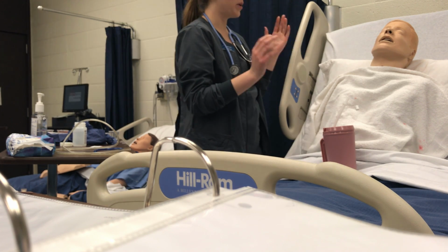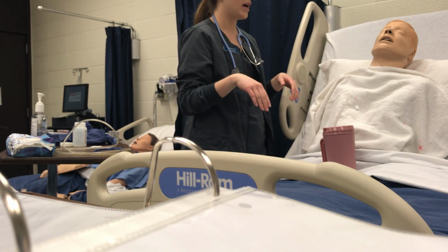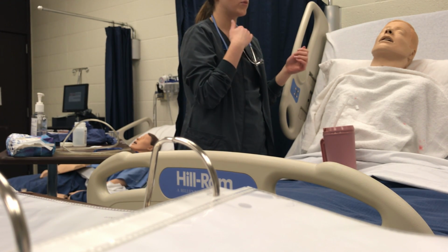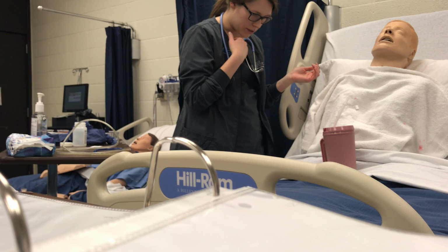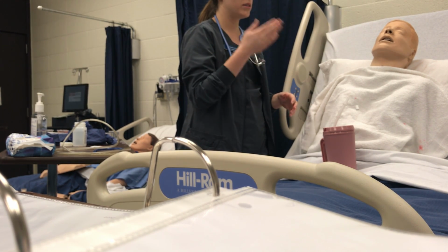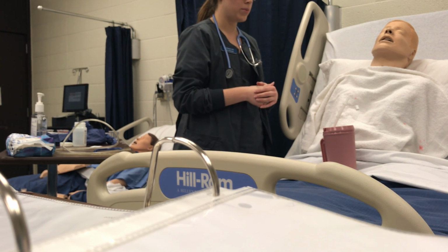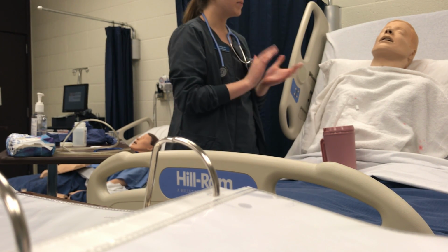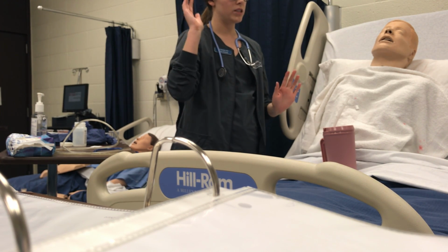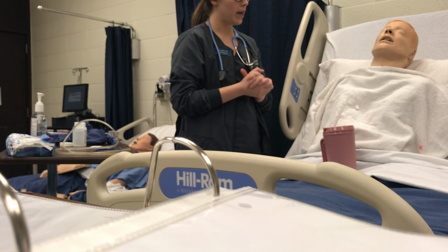I would explain to the patient that when I'm placing this NG tube, when it's advancing back, I'm going to have you first start off by extending your head backwards. And then once it hits the oropharynx, I'll let you know. And I'm going to have you extend your head forward, and I'm going to have you take some sips of water for me, okay? The sipping of the water is going to help it go down easier and make the process a little easier for everyone, okay? If it becomes too uncomfortable at any point, you just raise your right arm and let me know, and we'll stop and regroup and try it again, okay?